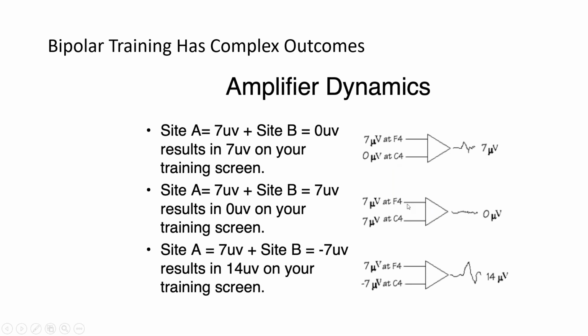And then they could both, you could be seeing everything going down and saying, oh, good, well, for a while it was up at 7, now SMR is down, we've got to get it back up. But in fact, the SMR at F4 and C4 now are both at 7. They're high, but you're thinking, oh, they're really low. And your software is saying, oh, they're really low. So your software is misreading the input from these things.